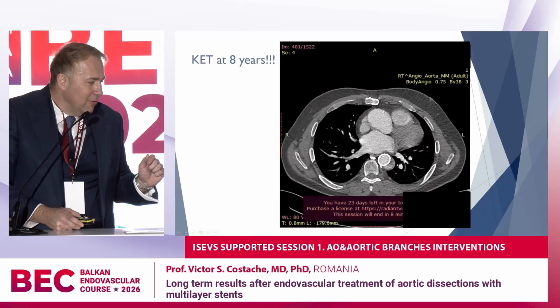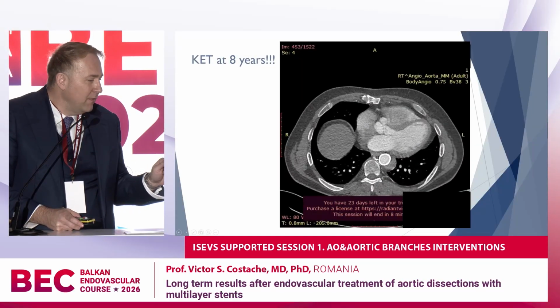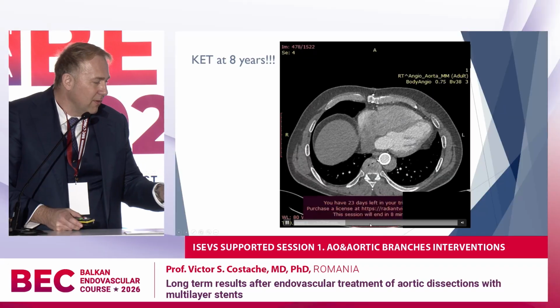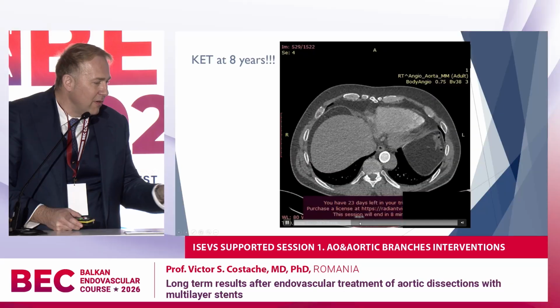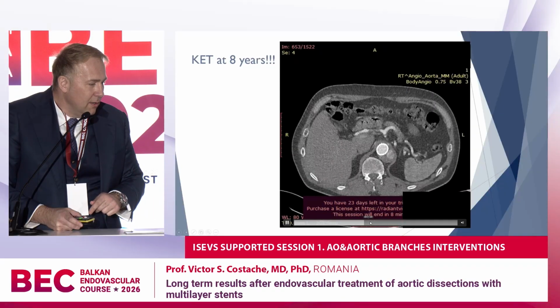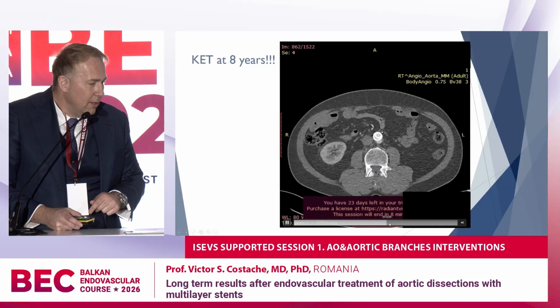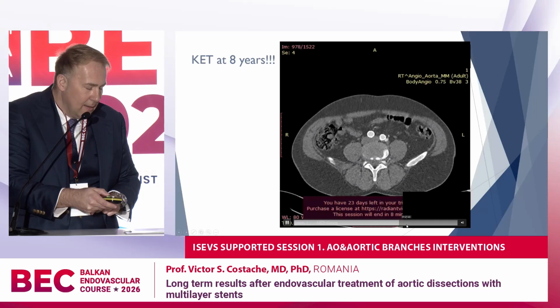No residual aneurysm. So this is where usually people who do stent graft click and they move forward, because they have a disaster, a big thoracoabdominal aneurysm. So here, no aneurysm. If you can go lower, lower, lower, lower, and you see complete remodeling towards the iliac.